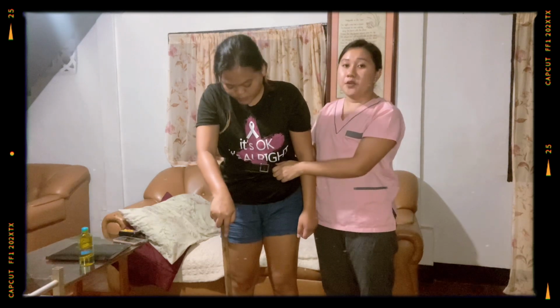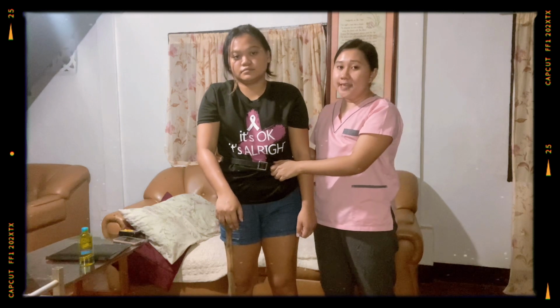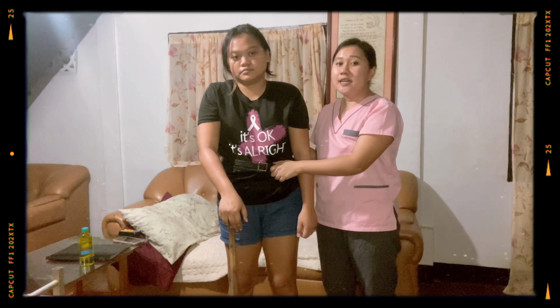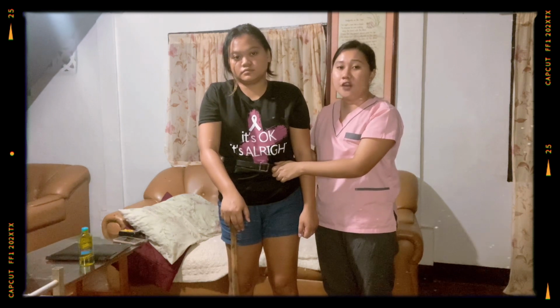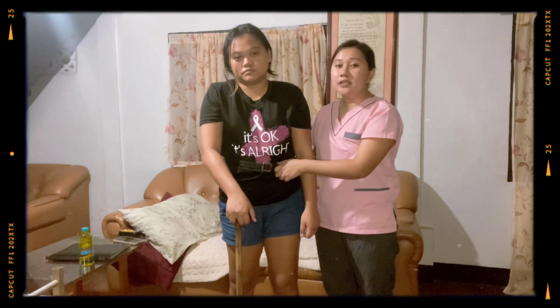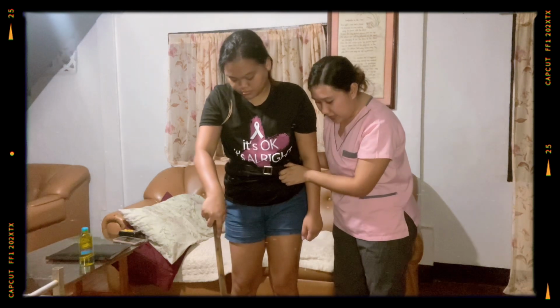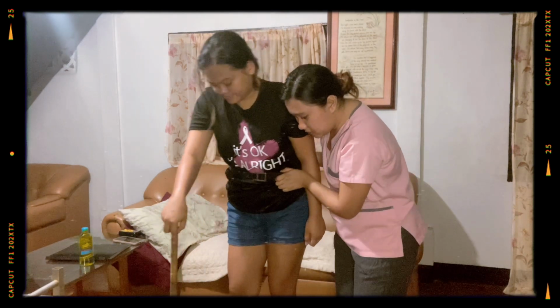So for procedure number 9, while supporting his or her weight on the weaker leg and the cane, have the patient advance the stronger leg forward ahead of the cane, heel slightly beyond the tip of the cane. So this is to aid the weaker leg and to feel the balance when moving. So, ma'am, let's continue, okay?